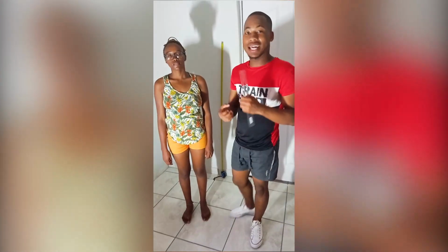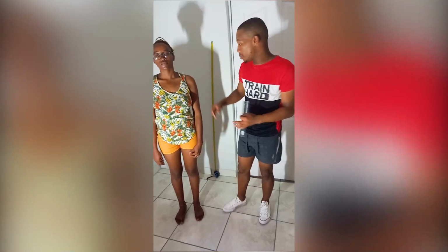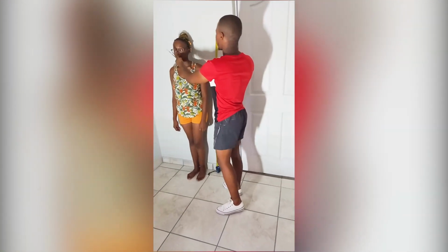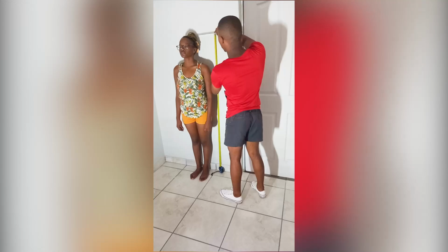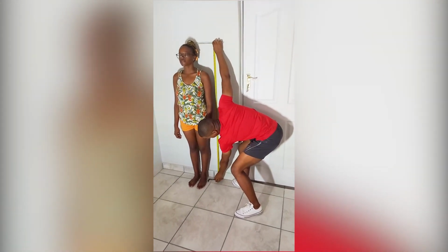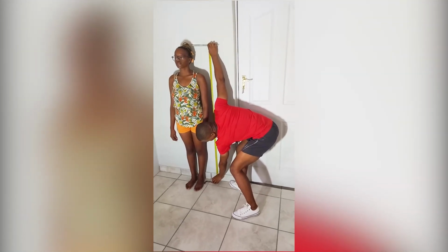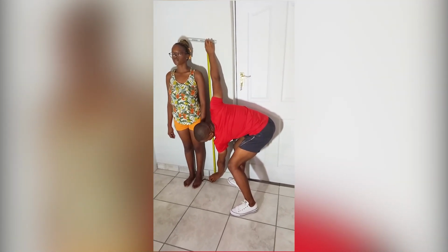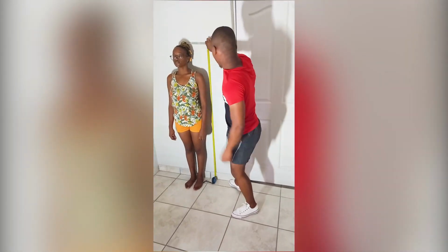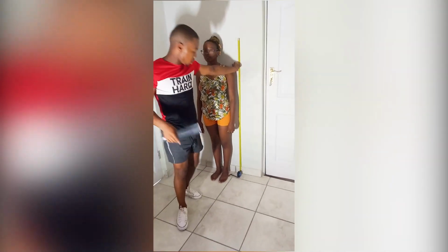Now I will take my client's height. Can you please lean against the wall? Thank you. My client's height is 158 centimeters.